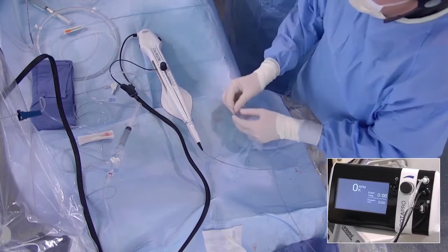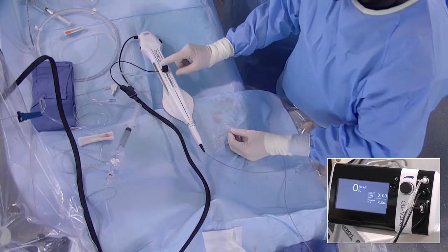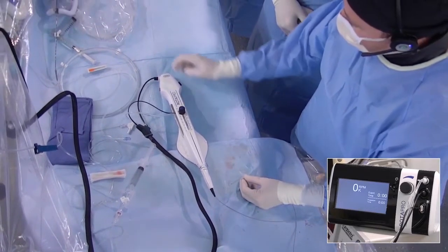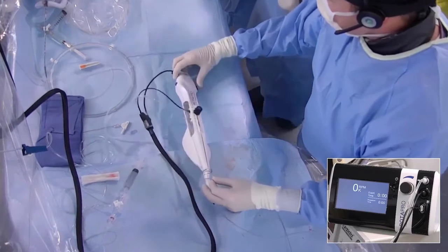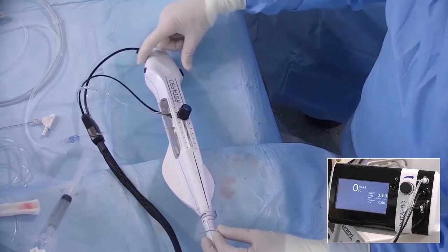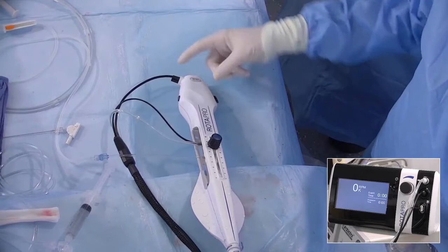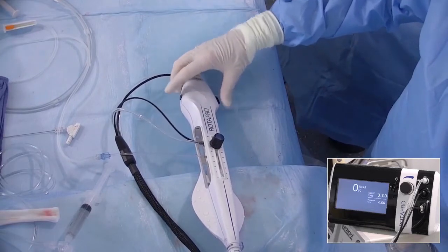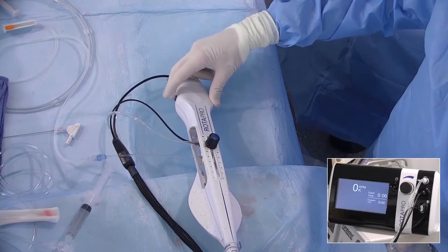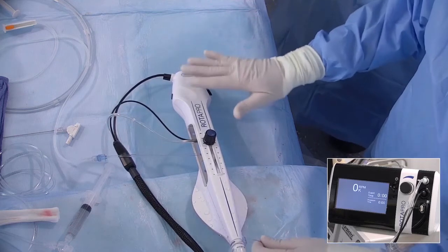And to use it, this button in blue, if you push, you start the burr. And there are two buttons, because when you start the button, the wire is trapped, and to remove it, you have to push these two buttons to remove the trap, and also to induce a small speed when you want to remove it. But we will show you this after.